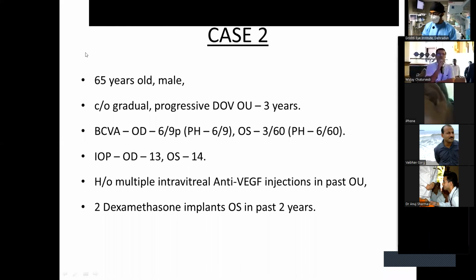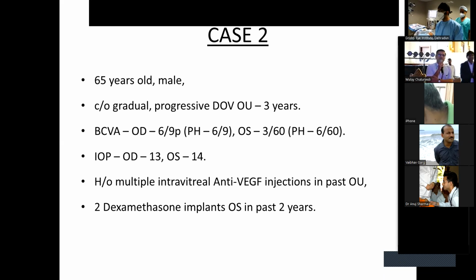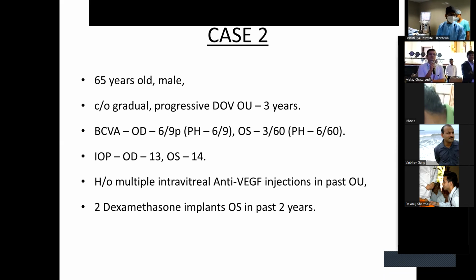Mohit here. I just want to know one thing: these days we are getting pre-fabricated povidone-iodine swabs from Glitch. No financial interest in that. Those beta swabs, any experience of using those for preparing the eye? Yeah, so I think Dr. Gaurav has been using these swabs. In fact, we have them in the OT right now, but I'm just using the standard swab sticks which I dip in betadine, and we can use the pre-fabricated ones as well.